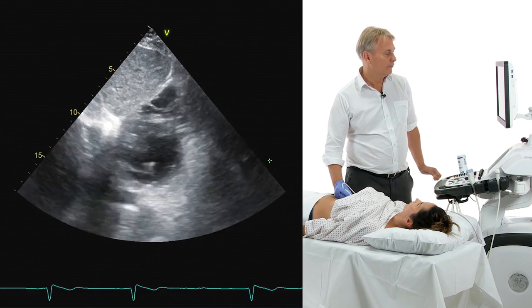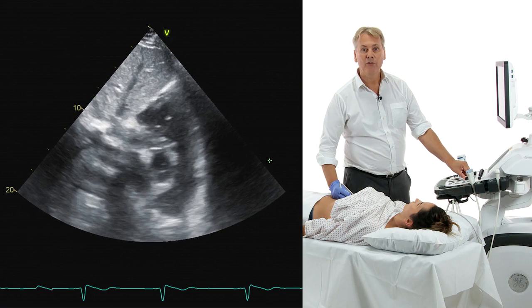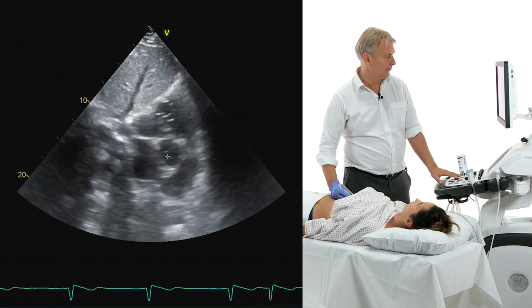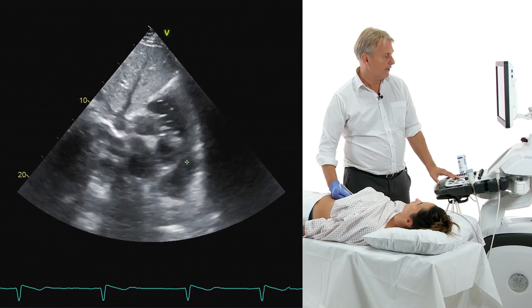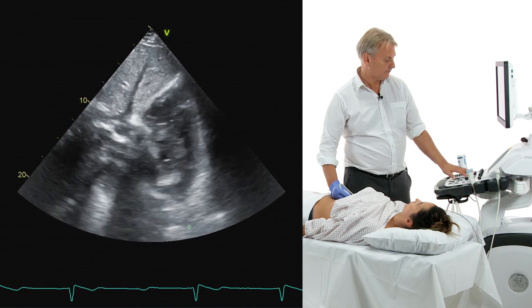In addition, if you rotate or tilt the transducer a little bit more to the right, you will get a view that you also know from the parasternal window. It's a short axis view, again with the aortic valve here in the center of your image, and the pulmonic artery with the pulmonic valve right down here. This would be the bifurcation, the right and the left pulmonary branch.